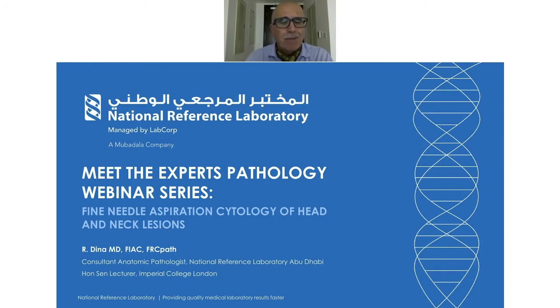agreeing to take your time and go through with me the cytology of the head and neck. I've been lead for cytopathology at Imperial College for almost 20 years. And as you heard, I have some experience with digital cytology, which is slightly more complicated than digital histology because of the intrinsic issues with cytological material, of course. However, we managed to scan these 4 cases, which we're going to discuss today.